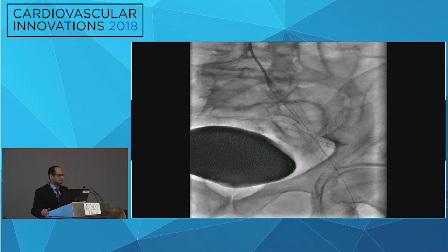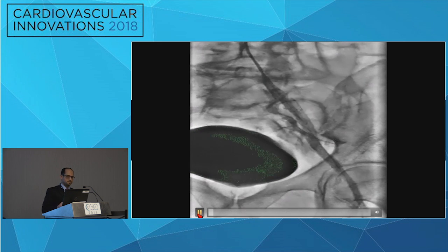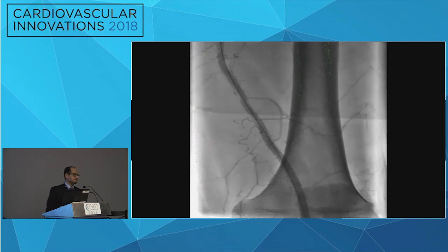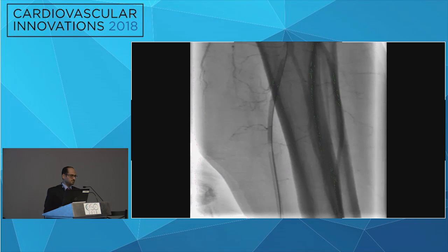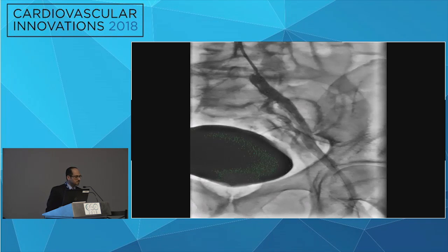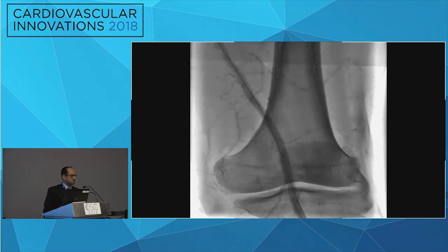Great case. Again, a lot of teaching points here, a lot of interest. First of all, I always say that when you're dealing with an occlusion in the iliac, you have to assume it's going to rupture. So everything is ready. You're assuming it's going to rupture. And again, was the patient under moderate sedation? Did the patient give you any indication that something could be going on here?